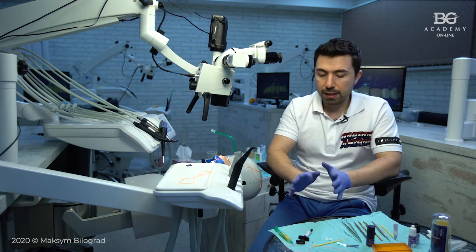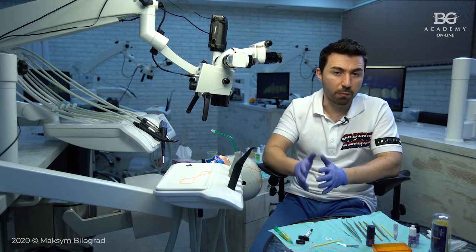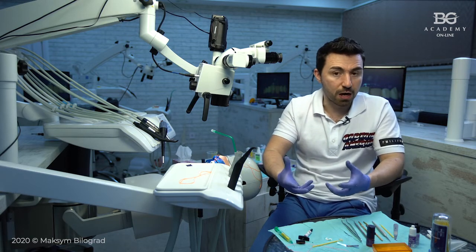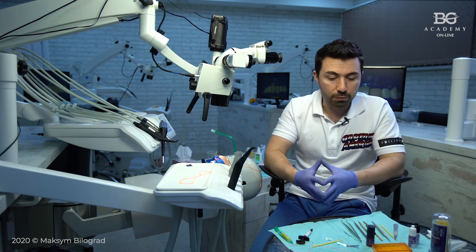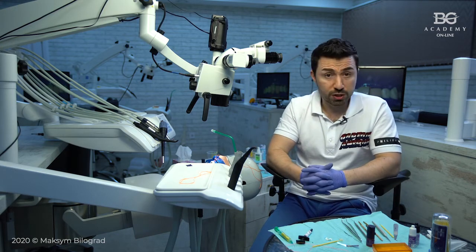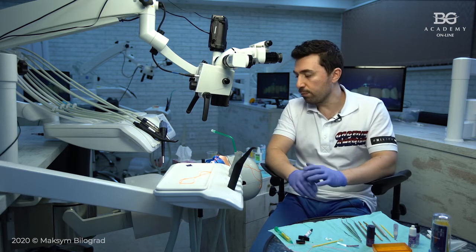For example, Genial Universal Flo from GC, or there is one from Tokuyama, there is one from Ivoclar. They're highly filled flowable composites. They are not the same as, for example, SDR or bulk fill flowable composites. Bulk fill flowable composites or SDR composites are good for dentin restoration when you do direct composite restorations, but for cementation it's better to use highly filled restorative flowable composites.